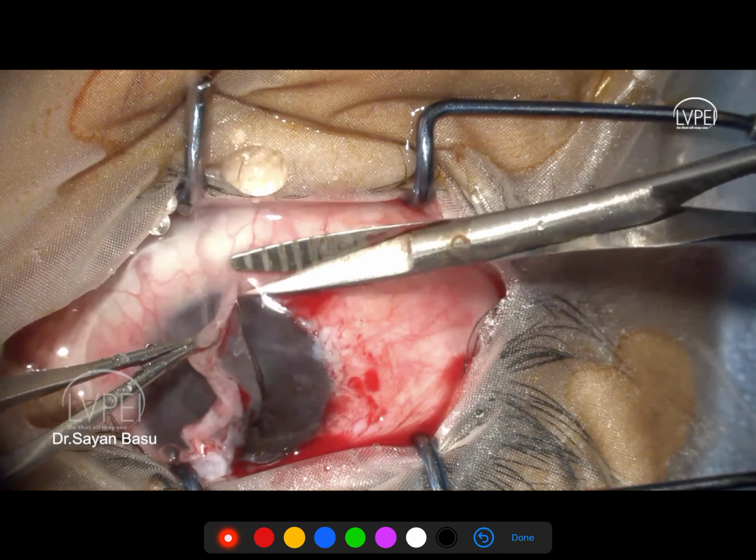And as you can see, it is basically repeating the same step over and over again. Now if you have too much bleeding and you're bothered by it, I am not bothered by it right now, but if you are, you can stop at this point, do a gentle cautery for 180 degrees and then proceed, so that you have a very clear field and you're not bothered by the bleeding at all. That's up to you. Here it's not really bleeding much, it's just oozing a little bit, and my nurse is doing a good job of spraying fluid so that the blood does not collect as it is oozing, and then I can keep going and complete the dissection without having any trouble with visibility.